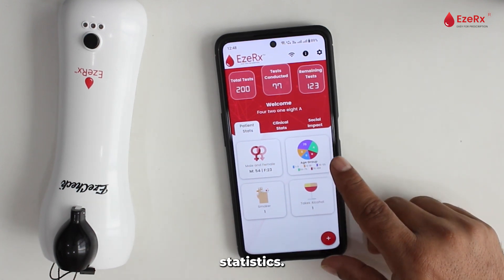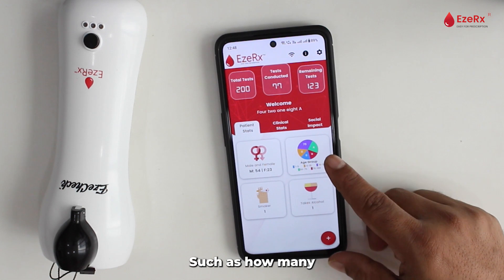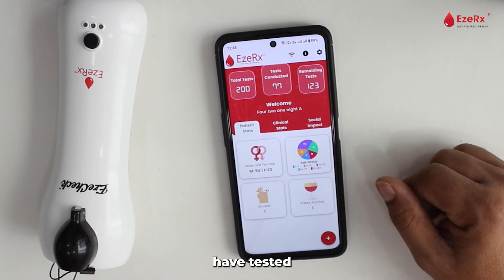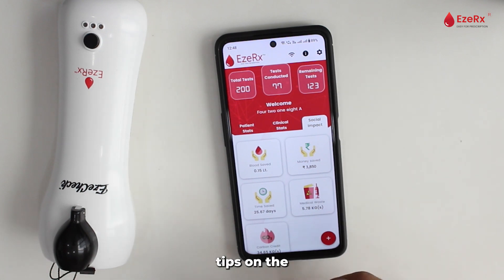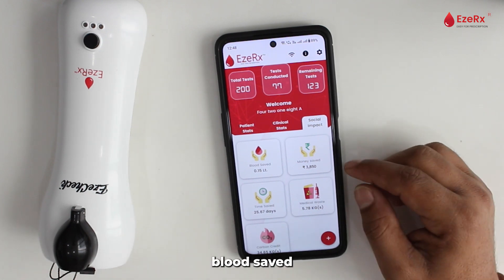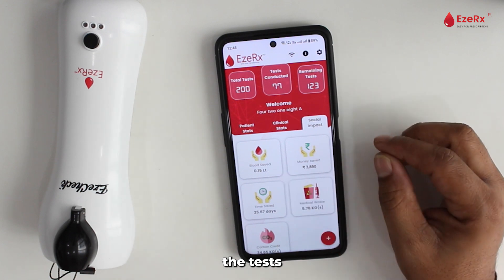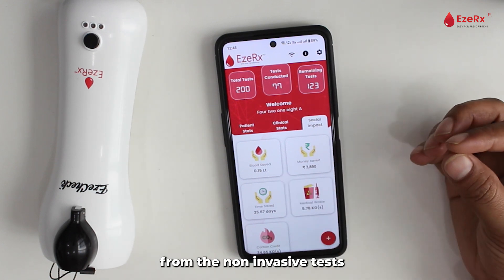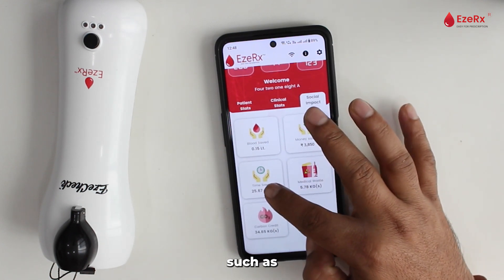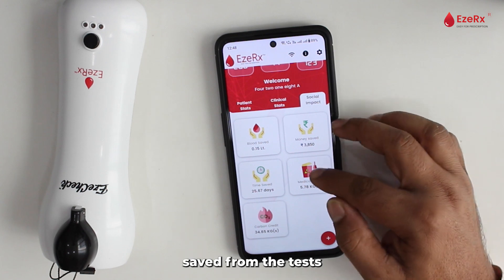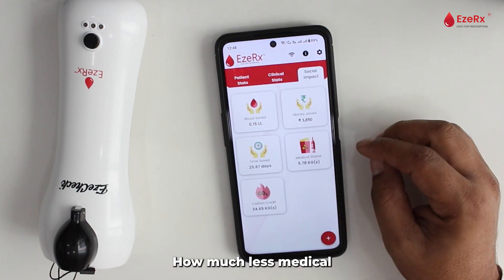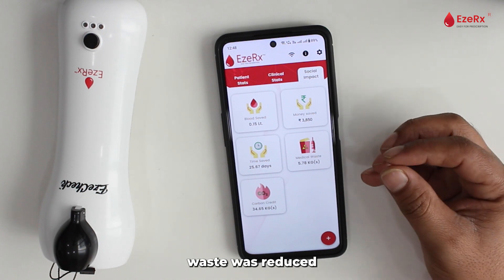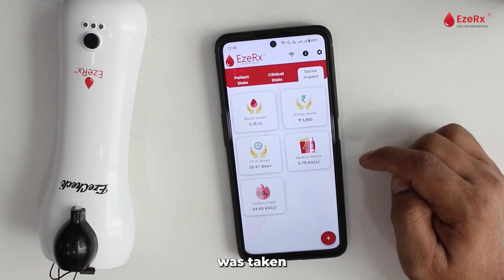You will also find clinical statistics, such as how many people with anemia were tested. You can also view themes on the social impact, such as how much blood was saved from the test, how much money was saved, how much less medical waste was generated, and how much less carbon credit was used.